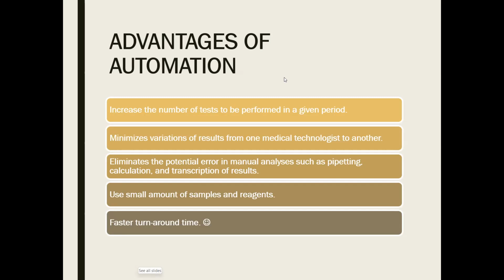Now, what are the advantages of performing automation? Well, definitely, aside from it makes our life easier, it makes the life of a medical technologist easier, no? It is capable also of increasing the number of tests. Could you imagine if you are going to use a spectrophotometer and you have to run samples, no?